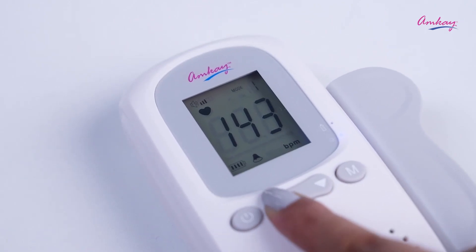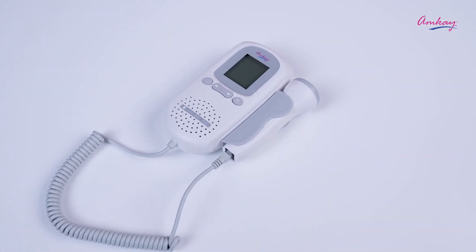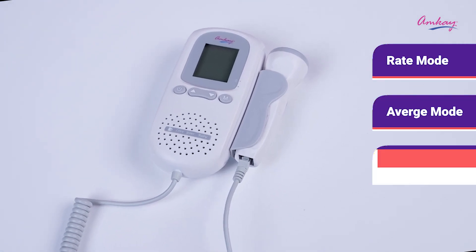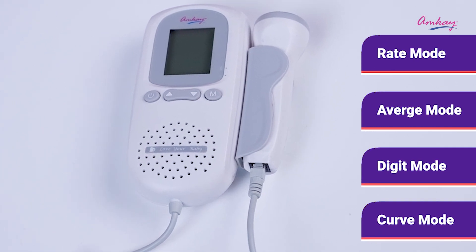Press the arrows to increase or decrease the sound. While pressing M, you can select amongst four modes: rate mode, average mode, digit mode, and curve mode, which you can select according to your need.